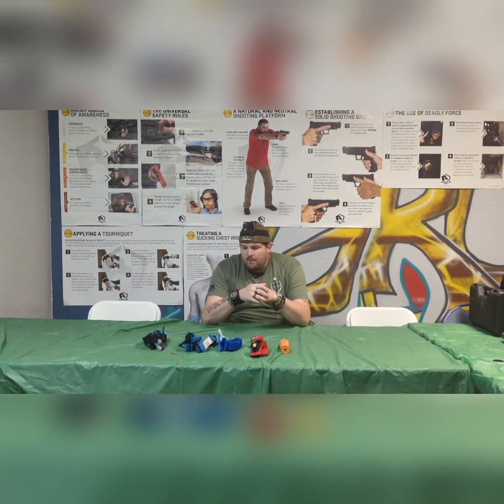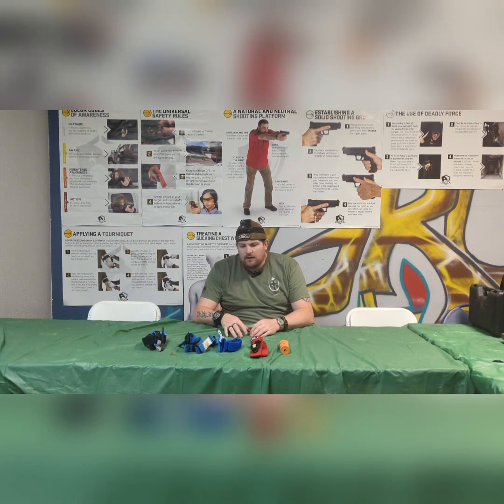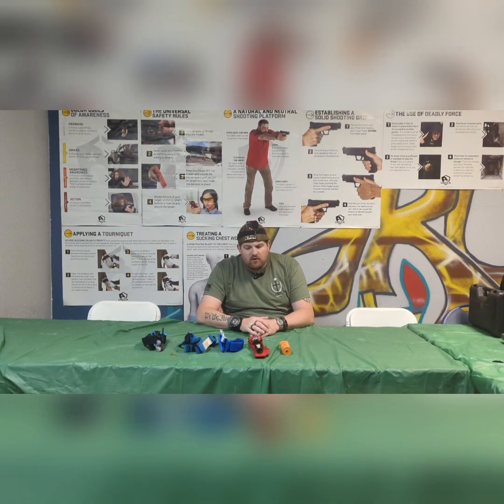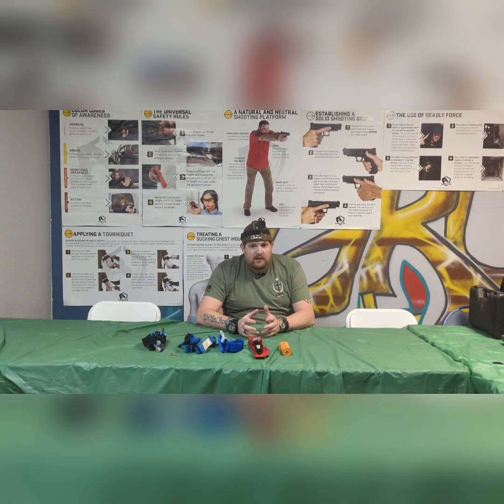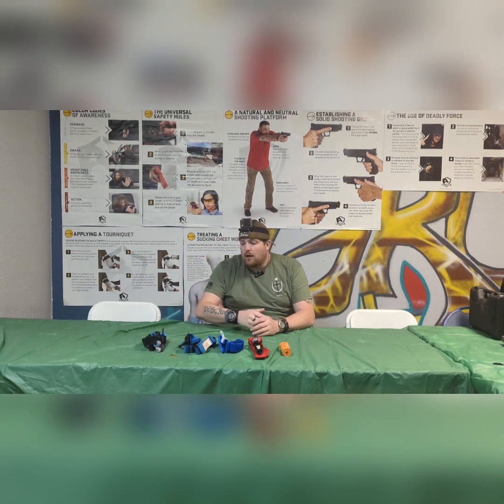So we're just going to talk about some tourniquets that I teach at my company. All of these are either trainers or they're high vis that I loosen up and stretch out so that they can be used as trainers. We'll talk about those and what I think about them. There's a bunch of them. What I recommend is you find out through the TCCC council and committee what is approved. There's a bunch out there that is approved, and these in front of you are all approved.